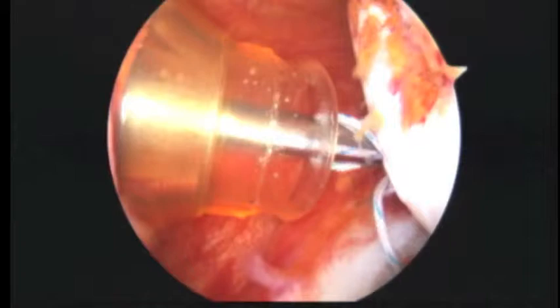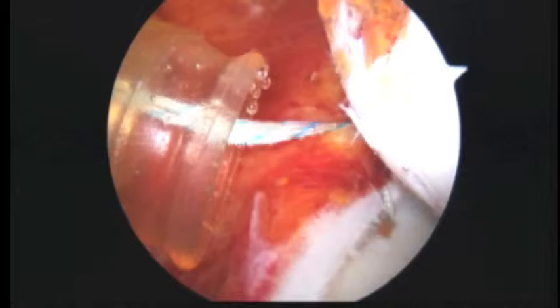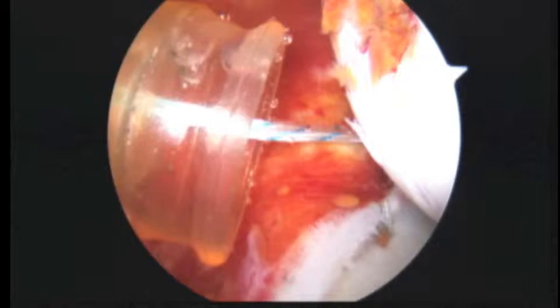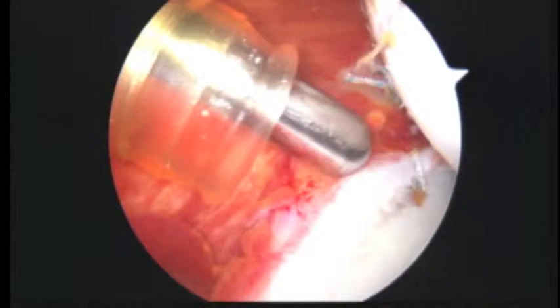You can see how this is going to not only hold that labrum down, but also bring the capsule up — which is exactly what we want it to do. We'll finish this knot. Now we're going to switch our cannulas, because the rest of our work is going to be primarily on the front of the shoulder. You can see that suture we tied in the back here — that looks good, and that's going to hold this part together.